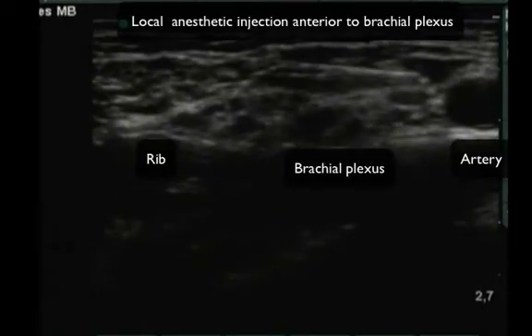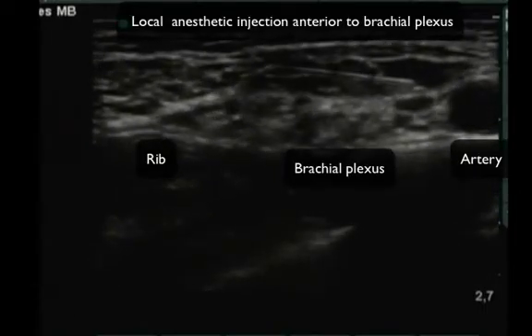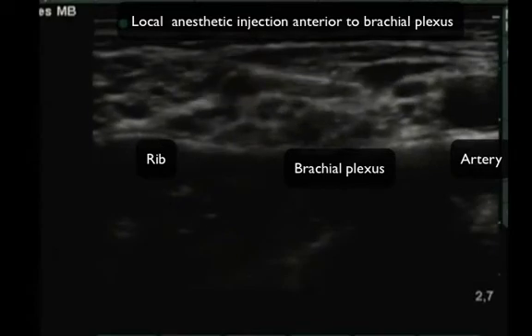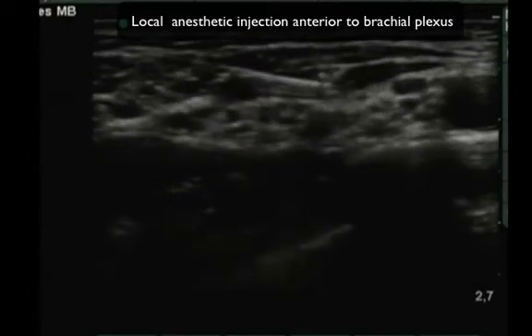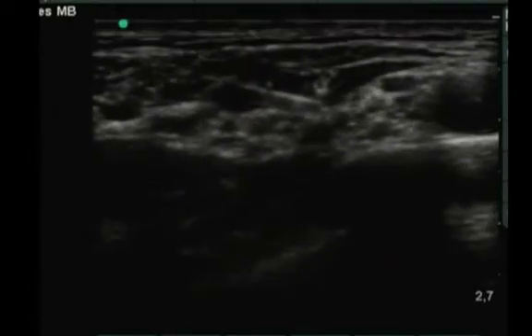At first, we observe the injection of local anesthetic solution at the anterior surface of the brachial plexus.